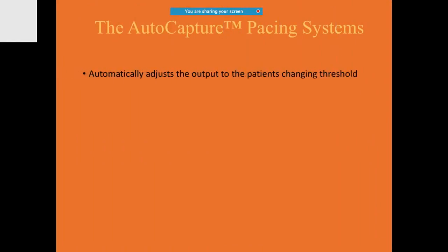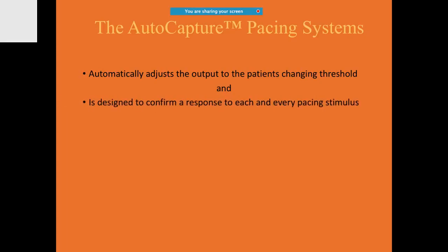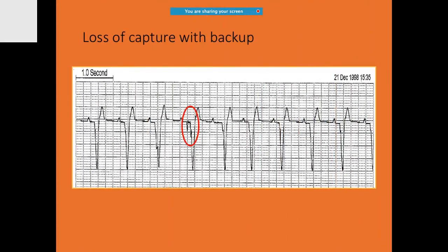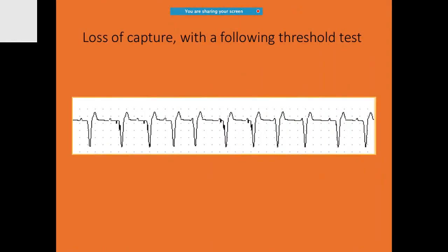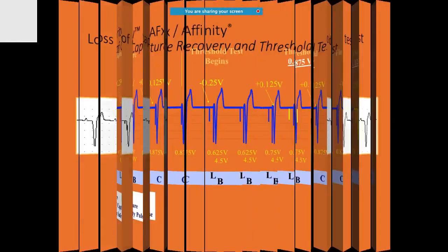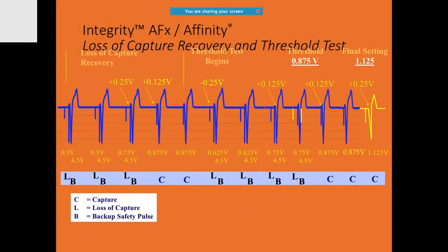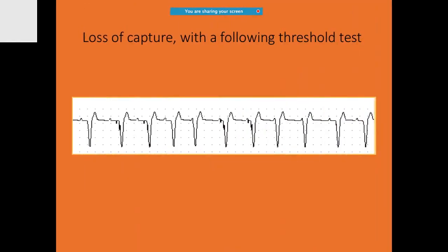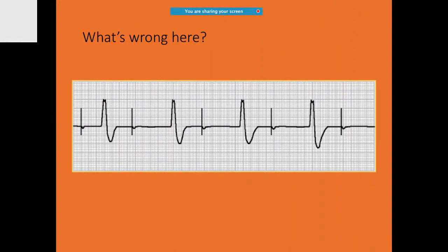There's a feature of one of the pacemakers called auto capture. It tends to automatically adjust the output. What do you notice over here? There is loss of capture, but it is associated with backup safety pulse. There are a few complex things you are able to notice: there is capture, loss of capture, and sometimes backup safety pulse as well, which is coming into play.